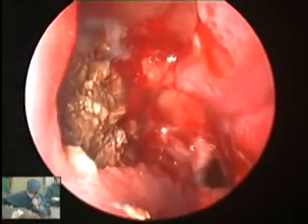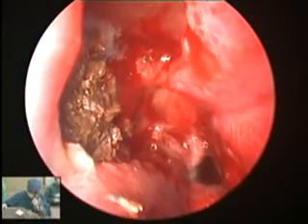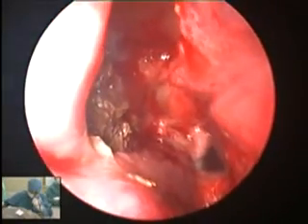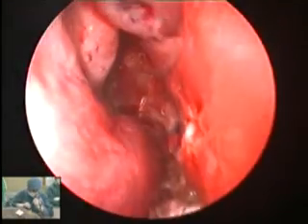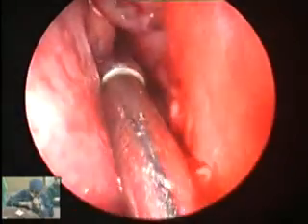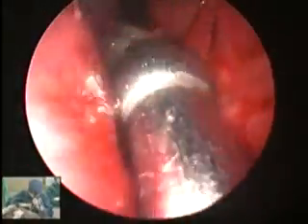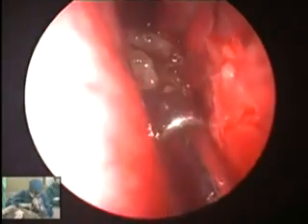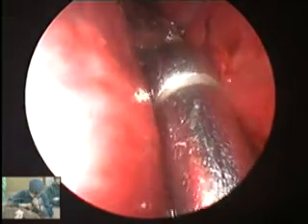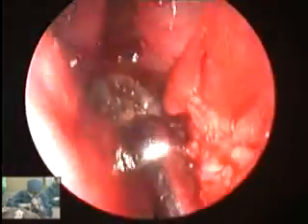So the good thing about a fungal ball is that it has a very good prognosis for the patient. Once you remove the fungal ball, there's not a high tendency for recurrence of disease, and the patients normally do very well surgically. You can see how the fungal ball has widened the middle meatus there as well, because Sham's able to start removing a lot of that fungus, and he hasn't done an uncinectomy yet, so there's significant widening of the middle meatus by the fungal ball.